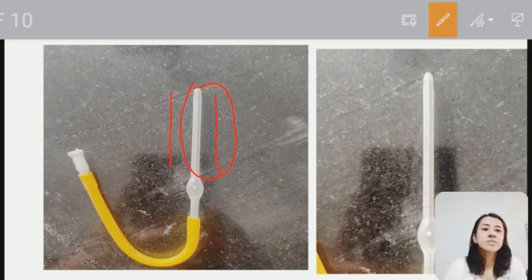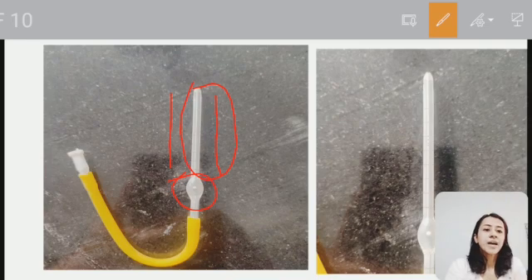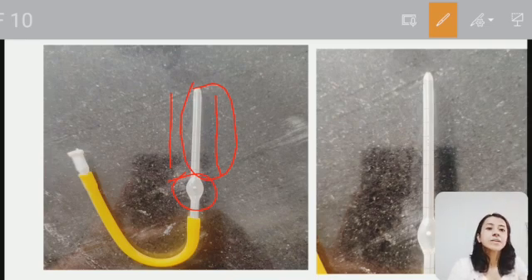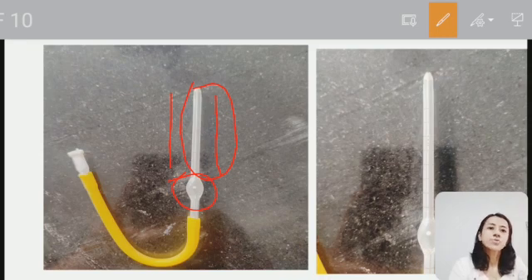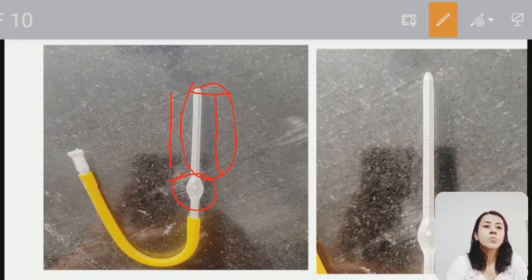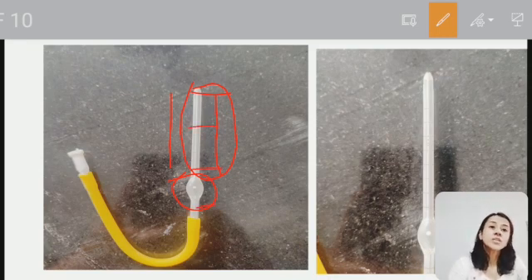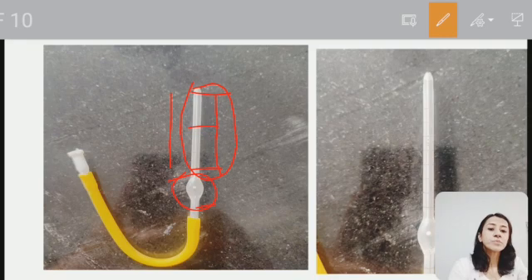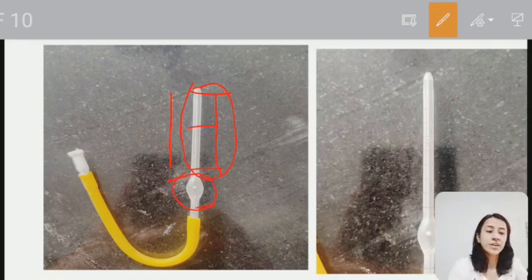This bulb has a bead. The bead in the WBC pipette is white in color, so you can easily differentiate it. It has markings of 0.5, 1, and 11. The use of the WBC pipette is to dilute blood with the WBC diluting fluid when we perform the total WBC count.